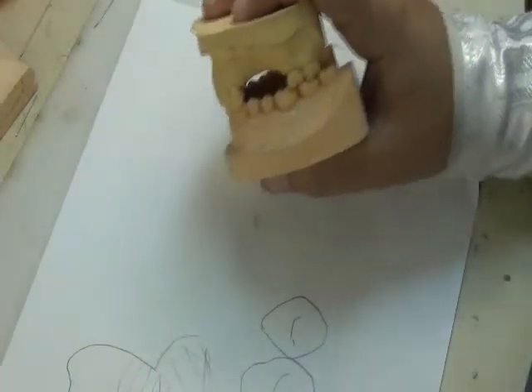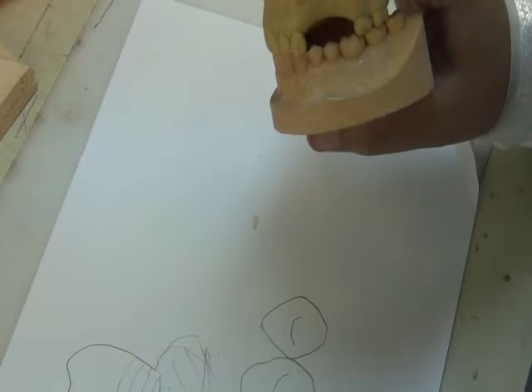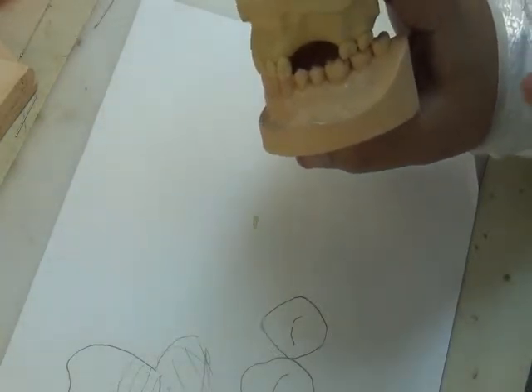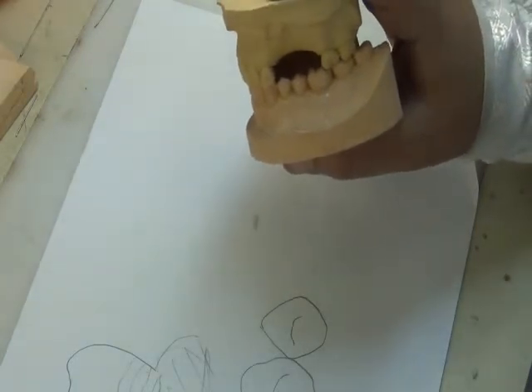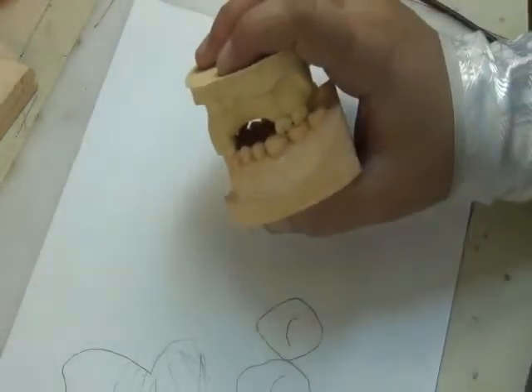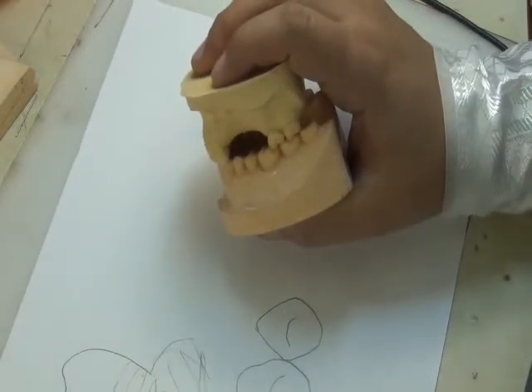In this case, simply set the teeth according to the opposing. We put the functional cusp in its location. The upper palatal in the central fossa of the lower. The lower buccal is in the central fossa of the upper. The overjet goes buccally. Okay? So simply, if we have a good opposing occlusion, we simply follow the occlusion of the lower.